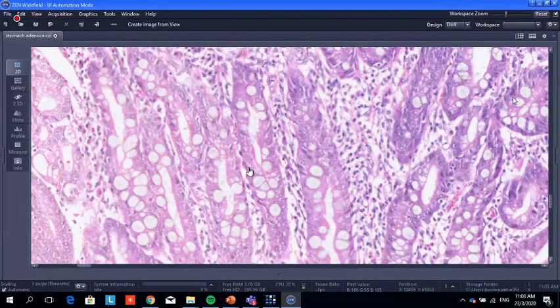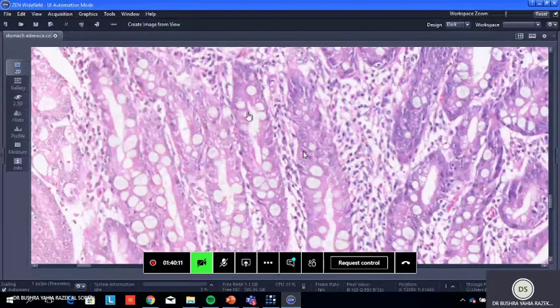Many layers. No, there are obvious changes. Is it more elongated? Metaplasia. What is metaplasia? Change of one mature cell to another mature cell. There is metaplasia, but what type of metaplasia? Columnar to squamous. Is this squamous? No, it is still columnar. But what is the metaplasia here?